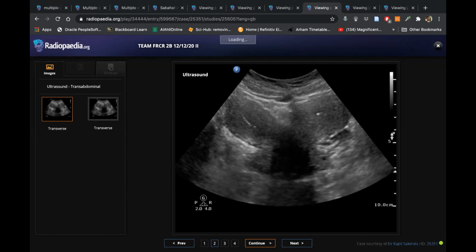Excellent. Okay. It's not very clear on ultrasound, let's say. And the patient has come to you with secondary infertility, right? So any other investigation you would like to do next after this ultrasound? We can proceed with the hysterosalpingography for the further detailed assessment.